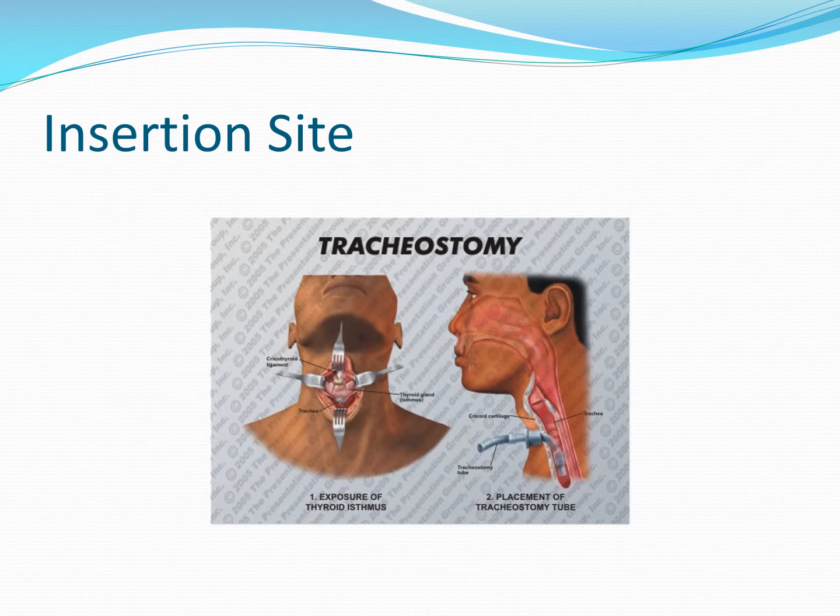This image is just to get away from the words for a minute and show you a little bit of what it looks like when the method is done surgically, even some of the instrumentation, the retractors that are there to expose the site so that the 7 layers of tissue can be gotten through appropriately and any bleeding can be minimized.